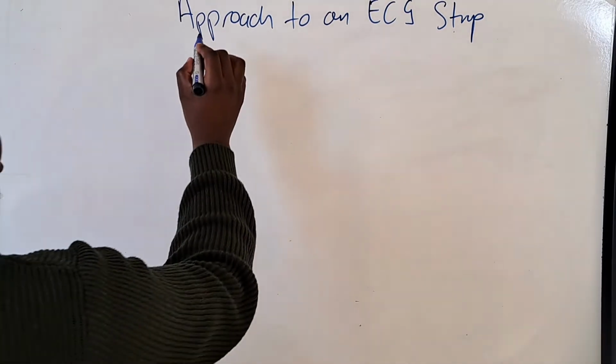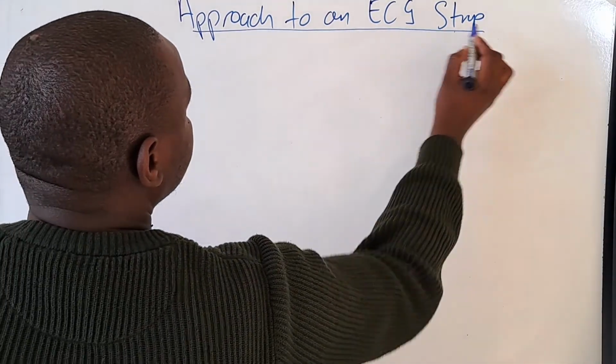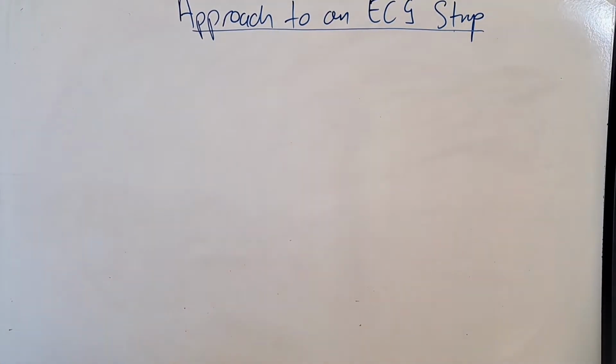And I said yesterday that many people have got their own approach. Many people disagree with some approaches, and other people prefer a certain approach to an ECG. The one that I'm most comfortable with is the one that I'm going to be showing you.